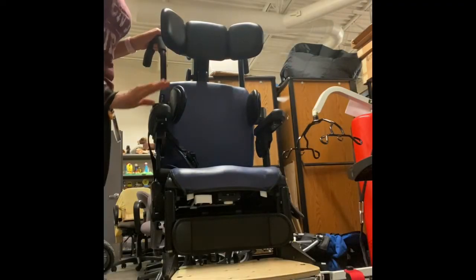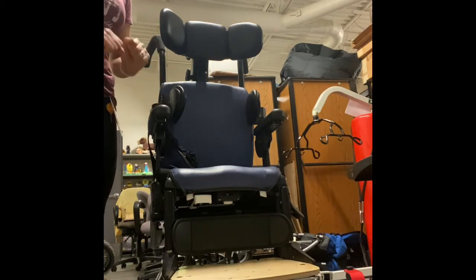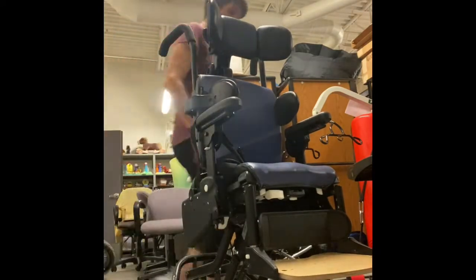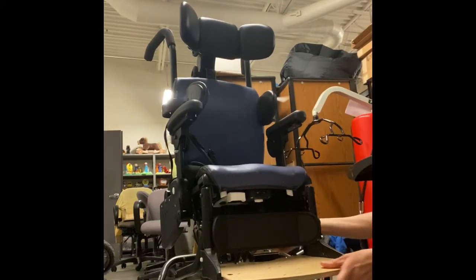Let's go over some minor adjustments to get optimal seating for your students or your children. Starting from the bottom and going up, here is your footrest. There's a little knob right back here under the seat — this little white knob right here. What you're going to do is press that and pull forward.